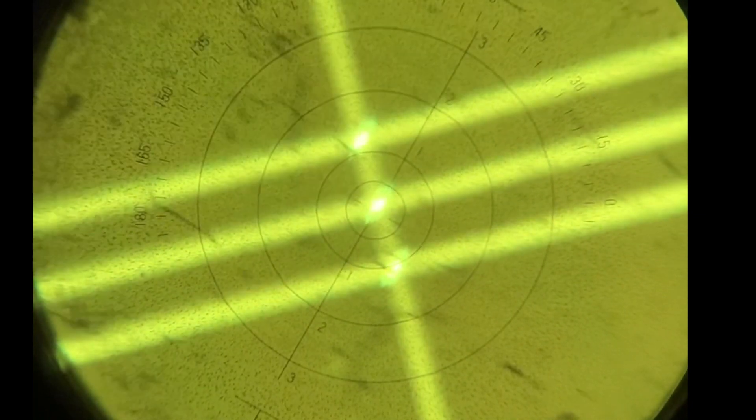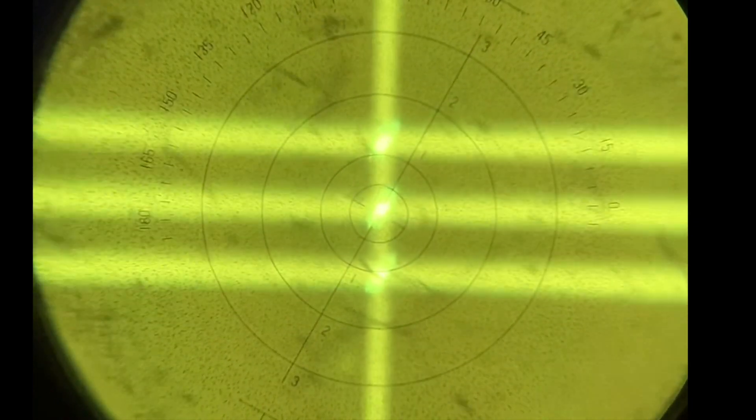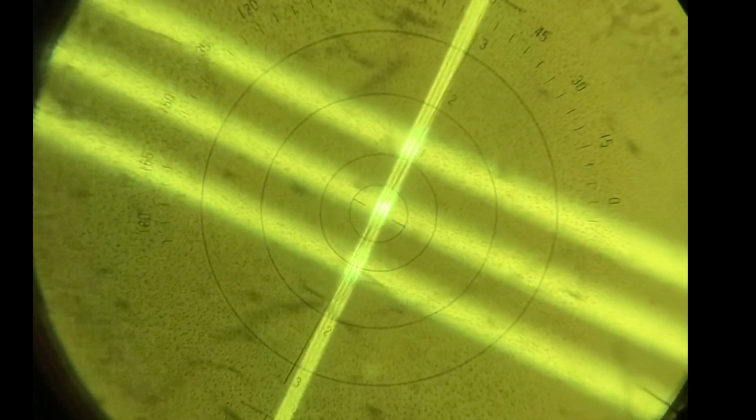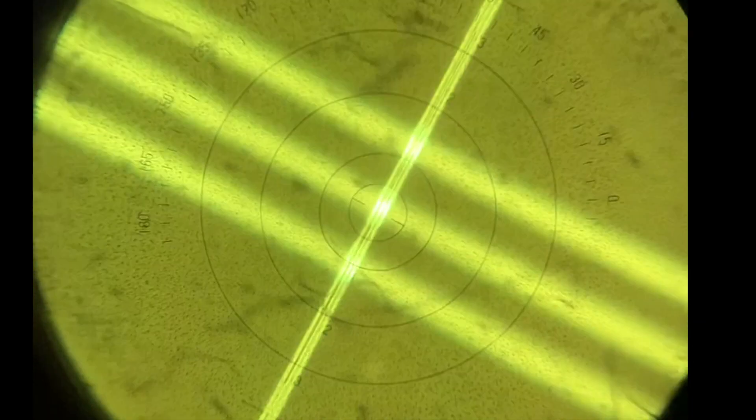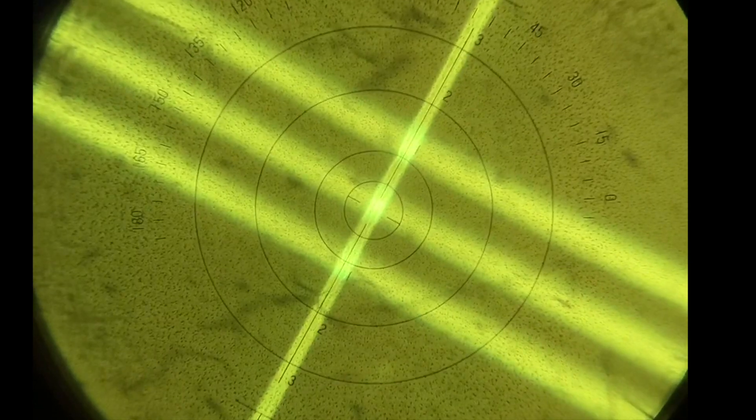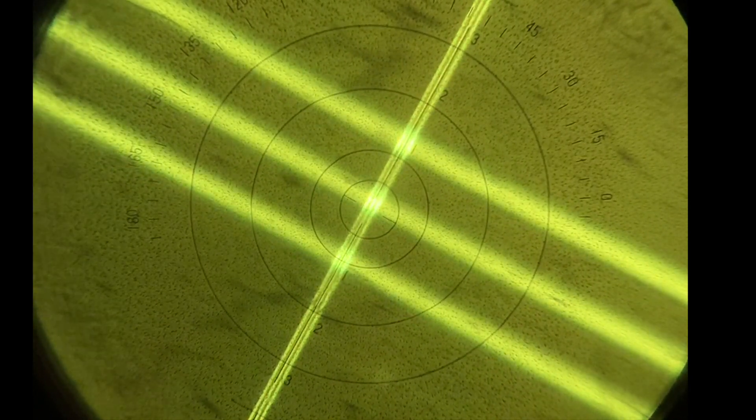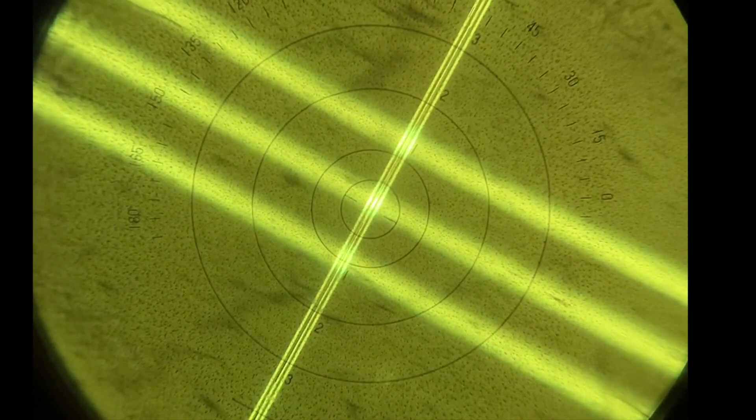Recall when looking at an optical cross, we are looking at the two principal meridians of a sphero cylinder lens. Therefore, in manual lensometry, we can measure prescriptions in both plus and minus cylinder.